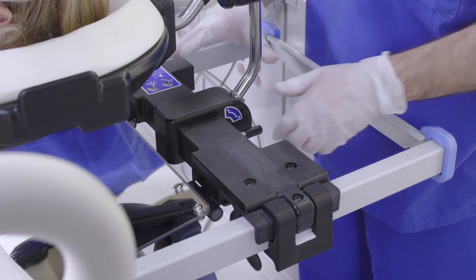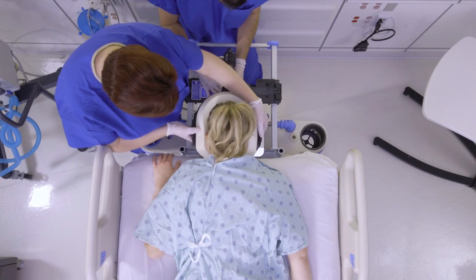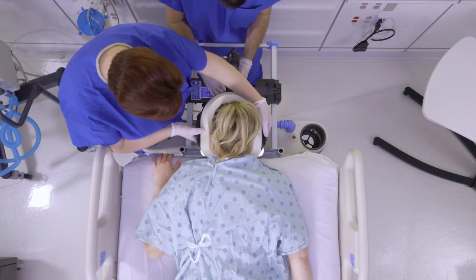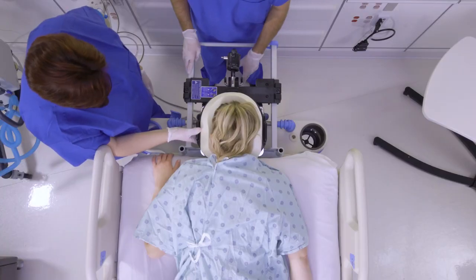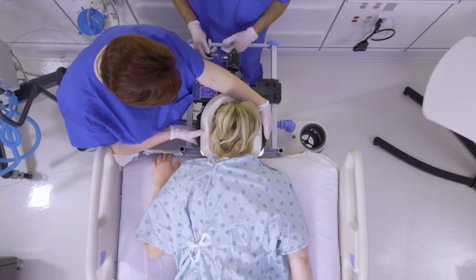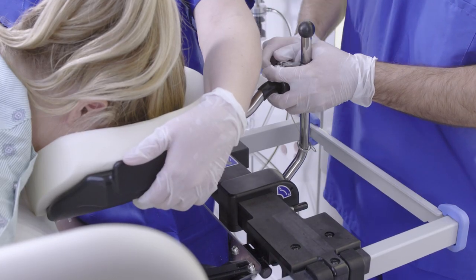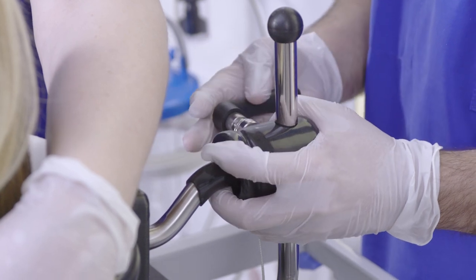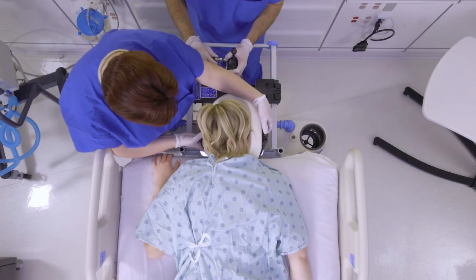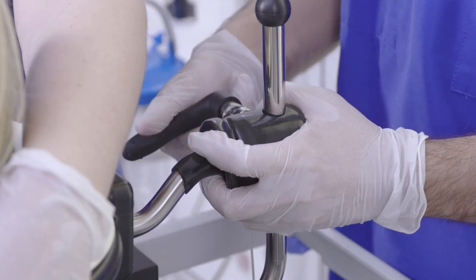Next, adjust the lateral shift by unlocking the lever. Support the patient's head and adjust to the left or right as needed. Lock the lateral slide. Using two caregivers, adjust the patient's neck to the neutral position. One caregiver must support the patient's head while the second releases the ball joint. Position the patient's neck as necessary. Finally, lock the ball joint.